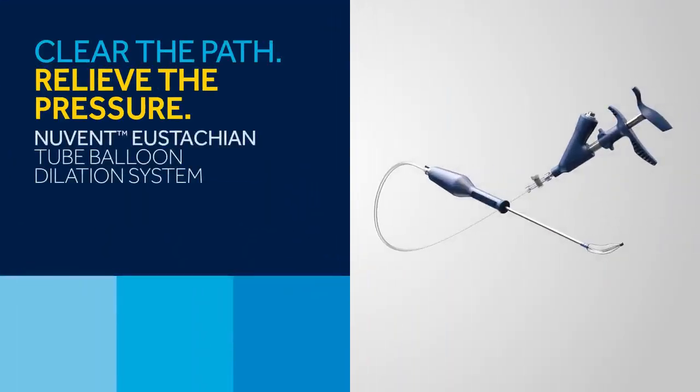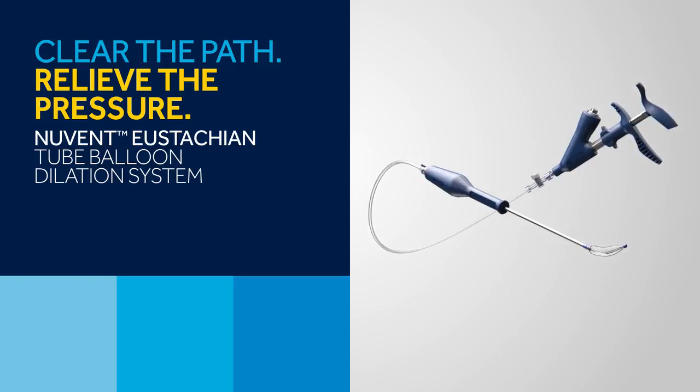The NuVent eustachian tube dilation balloon is indicated for use in patients 18 years and older who need treatment for persistent eustachian tube dysfunction. It is a manually controlled balloon catheter that, when inserted into the eustachian tube canal and pressurized, the balloon expands and dilates the eustachian tube canal.